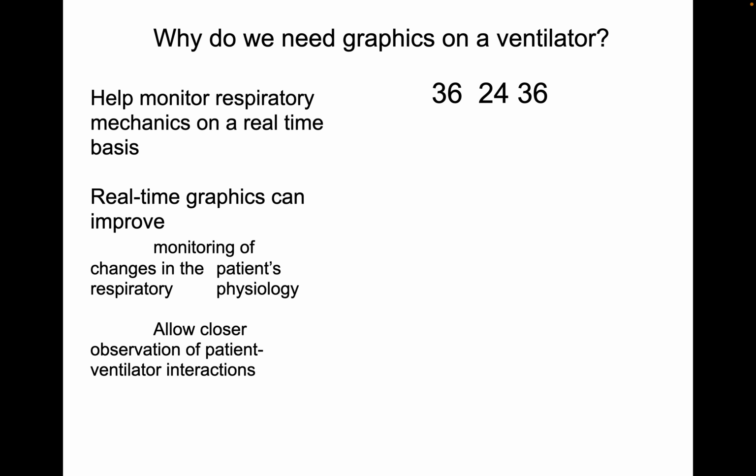So as we know, just pardon me about the next image, but for simple understanding, why do we need figures? Once we know figures, we form some kind of image in our mind. For example, if someone talks about 36 24 36, it can be something like this.